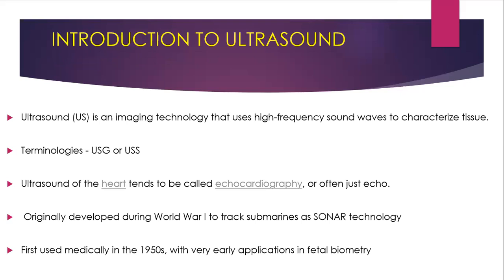In the introduction, ultrasound is an imaging technology that uses high frequency sound waves to characterize the tissues. The terminology most commonly used is either ultrasonography or ultrasound. The ultrasound of the heart tends to be called echocardiogram. Echo is from the word sound, cardio from the word heart, and graphic is to graphically represent the information. Sometimes people call it just echo.